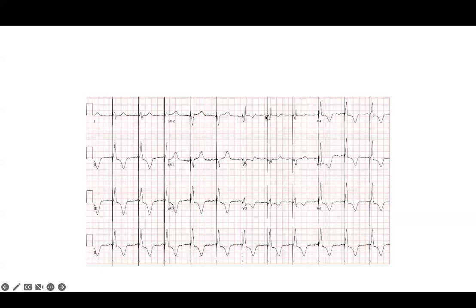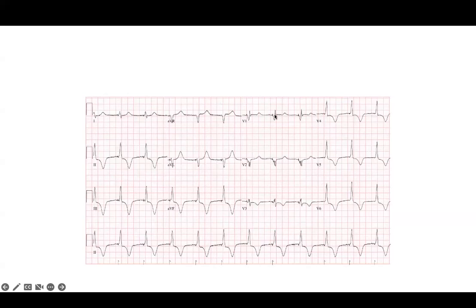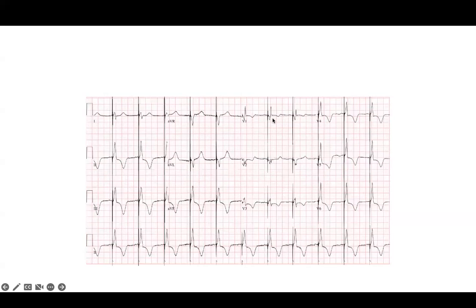I agree with Klaus. It's beautiful. This unipolar, it clearly stepped out. Look at this isoelectric interval that you don't see on the bipolar. Look here, this slurring is clearly taking the myocardium or the septum, right, part of it. Whereas here it's quite nice. It really steps out. I always look at V1, that sort of slurred start is never good. I go somewhere else when I see that, and often you can get this result.